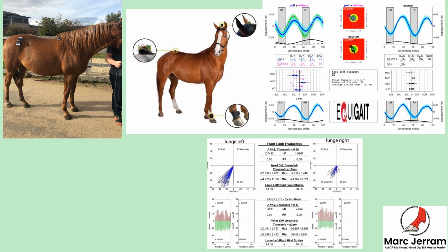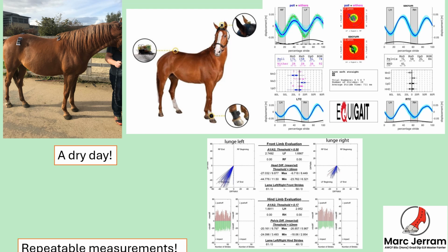These are all incredibly expensive for the initial outlay of purchasing these. And the few things you are relying upon are a dry day, because the last thing you want is these to get wet, particularly if you're using a computer on site to correspond the findings from IMU sensors to the computer. You want to be somewhere dry and under cover to work on the horses. Although the pouches of these are fairly watertight, they're not completely water sealed, so you are worried about those getting wet and potentially becoming damaged.